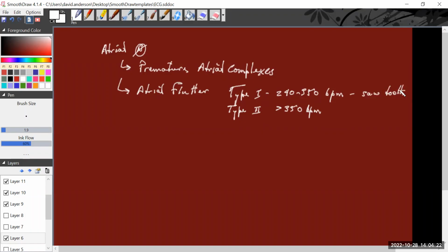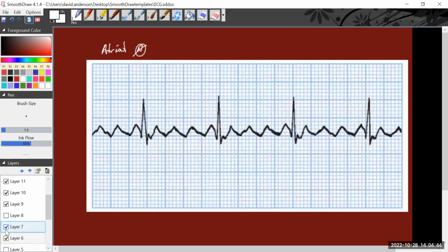And basically we know that there's some underlying cardiac pathology. There may be fluid overload. In other words, the cardiac pericardium has got some fluid filled over it, or there's some atrial ischemia. So our sawtooth is going to look a little bit like this.